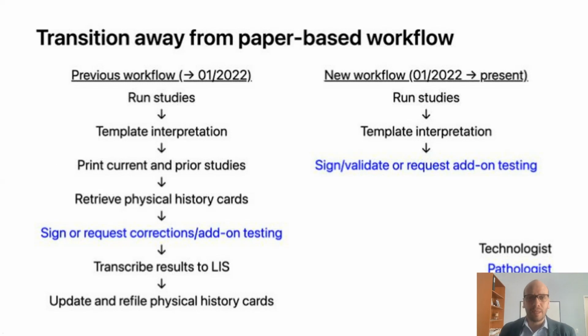What we came up with was that we could improve our efficiency by transitioning away from a legacy paper-driven workflow to a new digital-based workflow. This transition occurred in January of 2022. So on the left, I'm showing you our previous workflow.